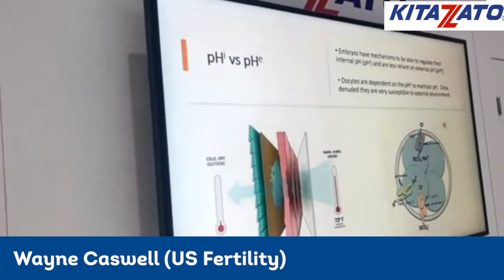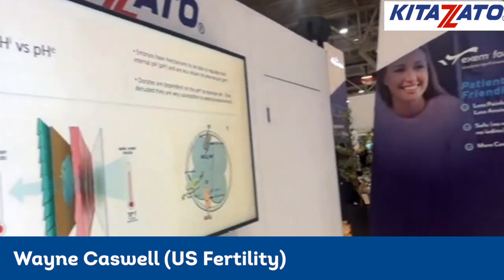So once you've denuded your oocytes, be much more diligent. Before you freeze them, how do you handle them? How am I doing everything? Because they are much more sensitive.